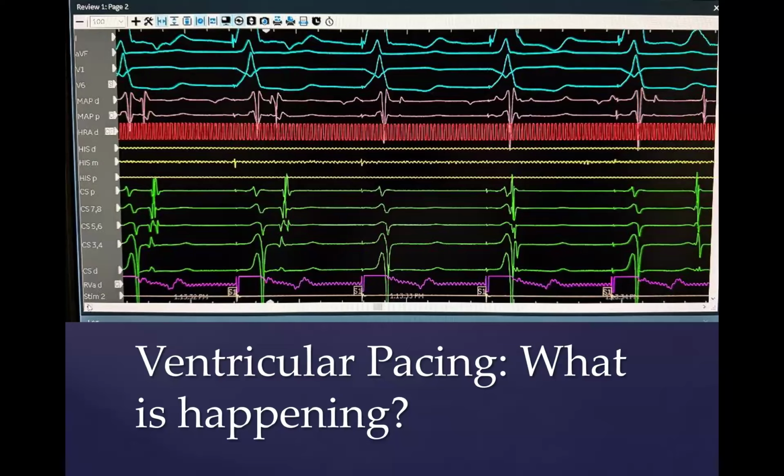There are other advantages to the other product that people like, with the most important being that you could use any ablation catheter with the other system. And so a lot of people don't like the CARTO ablation catheter. They find it stiff or difficult to manipulate. Some people like it. I myself like the CARTO catheters. Barry likes the catheters. Essentially, there are 2 types of ablation catheters: stiff and not stiff, and people generally tend to like one or the other.